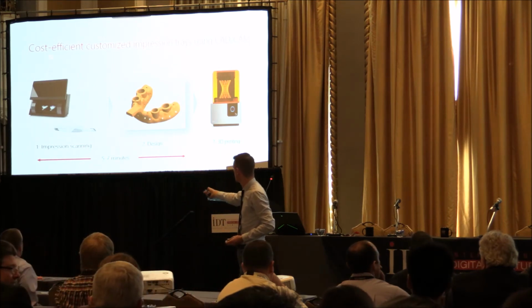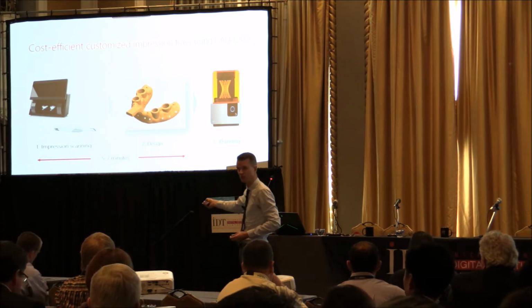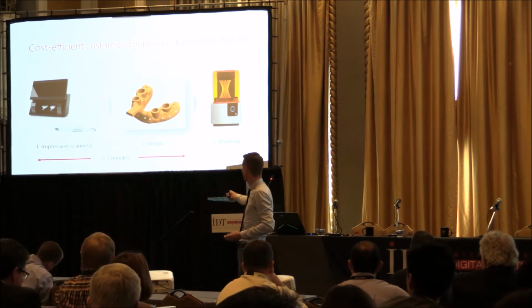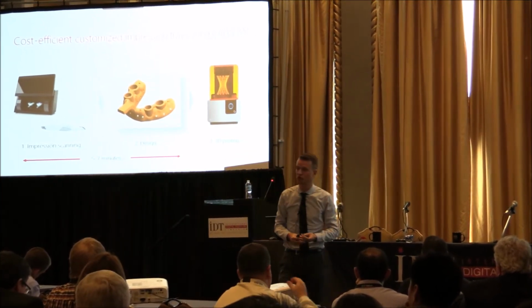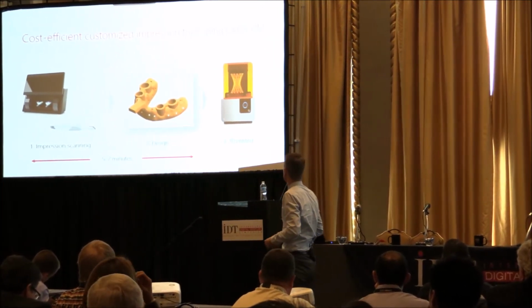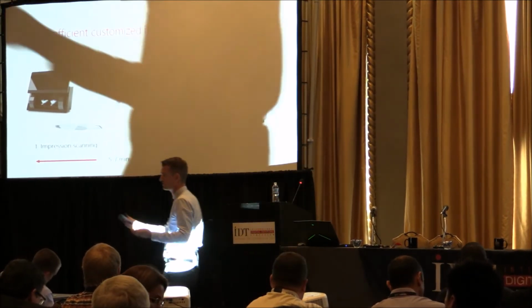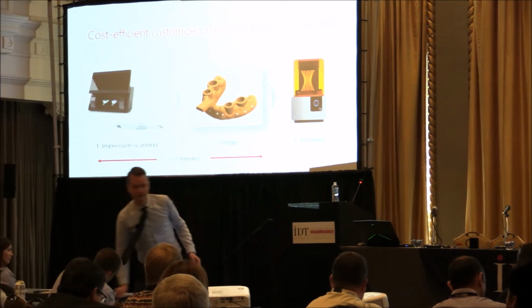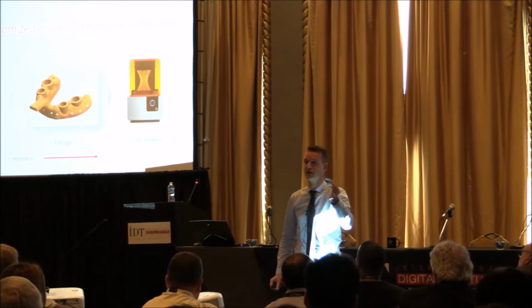And also one thing that's really cool is that if you design them, if you plan your implant position, if you do implant planning, you can place the holes for your transfer pins, if you're still doing it conventionally, in the system, and you can print on different printers that have materials. I'm just going to send a couple of those around here so you guys can see. Of course, this is a cheap product. I mean, does it make sense to print?